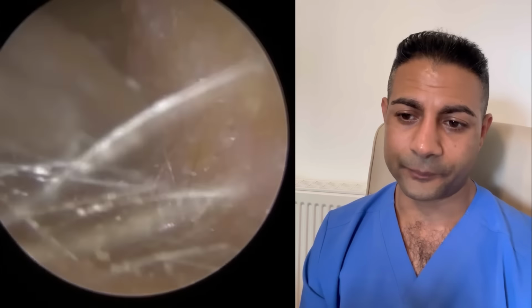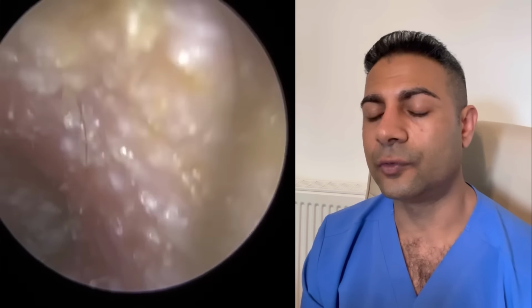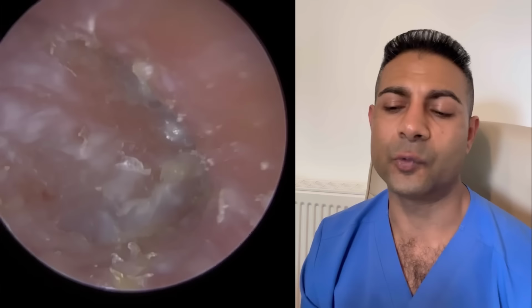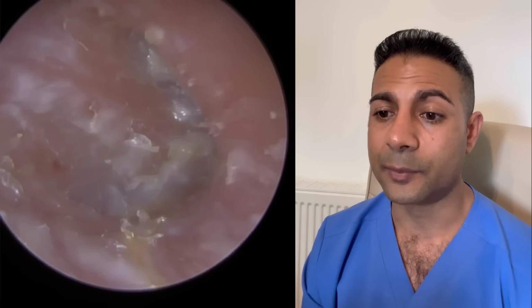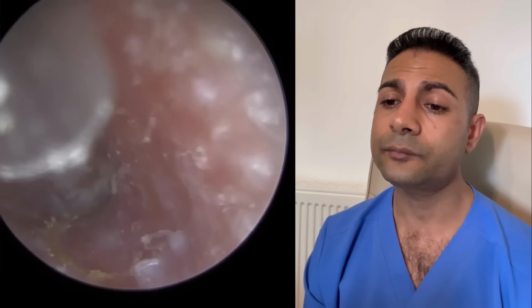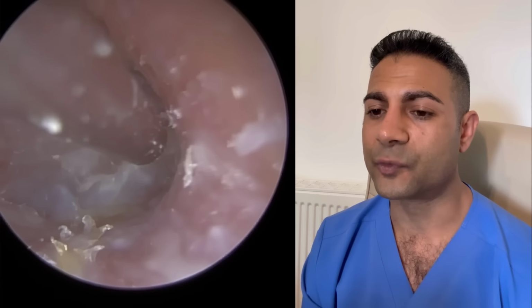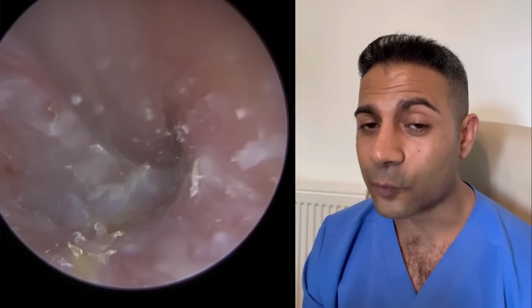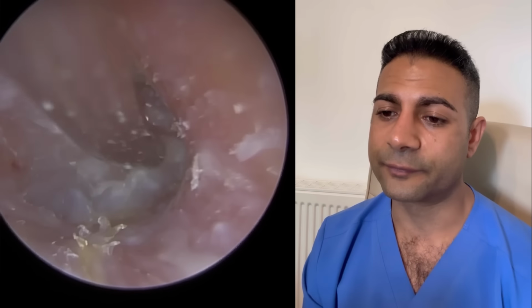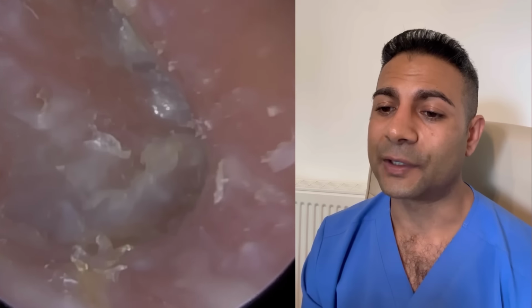And that's why if you watch any procedure, not only for myself, but the audiologist, nurses or doctors in ENT, whenever they're working on the bony part, they're a lot more careful. I've had some trauma to my ear canal before on the bony part, so I'm fully aware of how much discomfort, and it's a very acute pain that it can cause a patient.